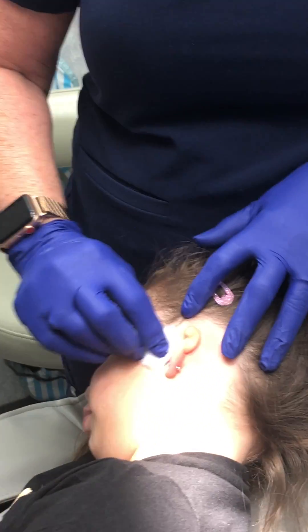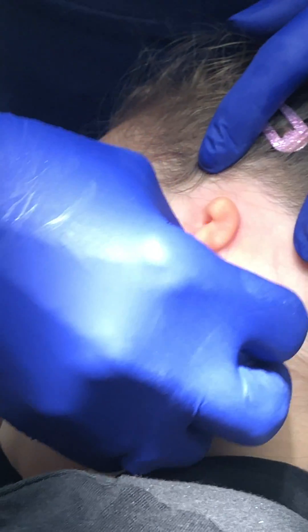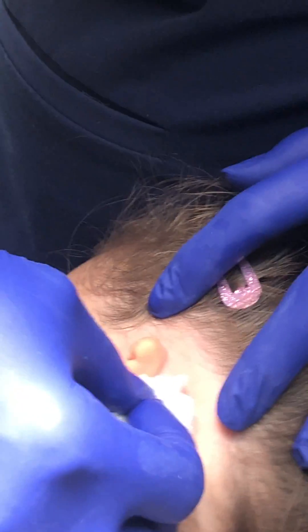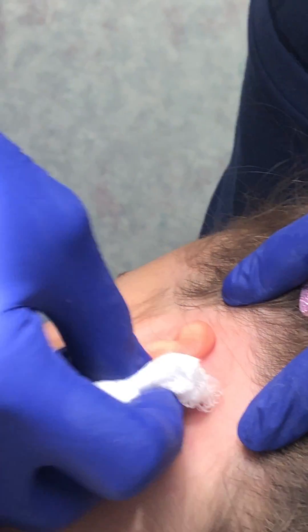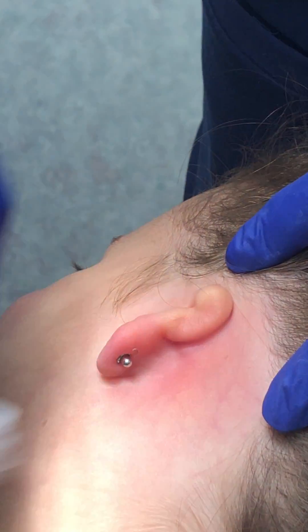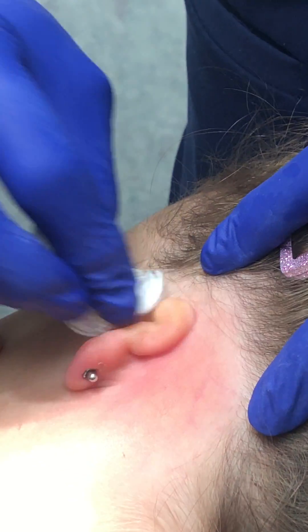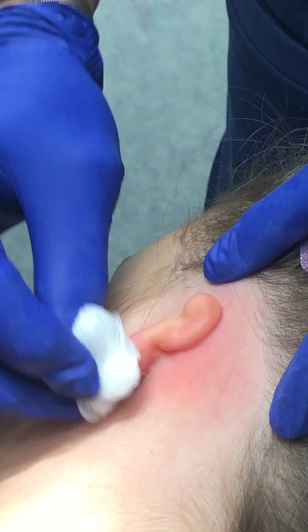So first we start with witch hazel or alcohol. In the morning she uses soap and water to clean the area so that the skin around the ear is very, very clean, and we don't have any residue from the night before or any oils on the skin, because then the glue will not adhere to the skin.